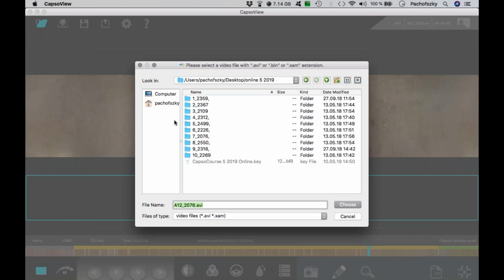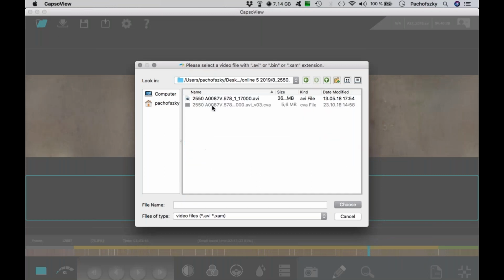You can also type down your questions on the chat window so I can pass it on to Dr. Pachofszky. Maybe I will go on with the next case. Please. Even if there are some questions I will interrupt. Yes. But it's a quite short case.